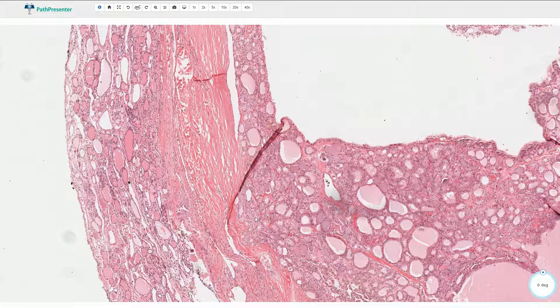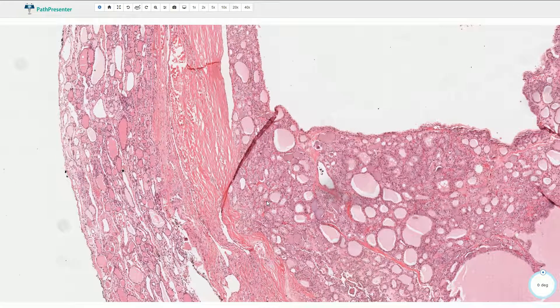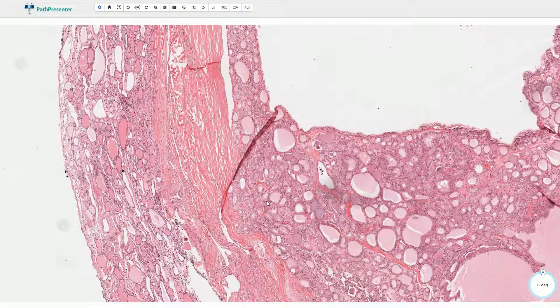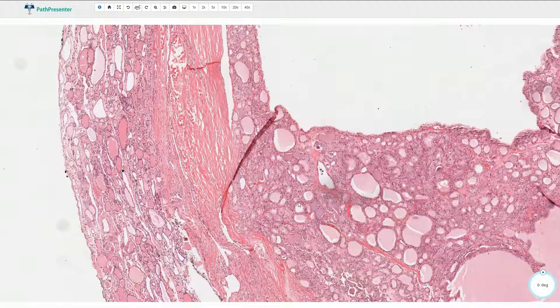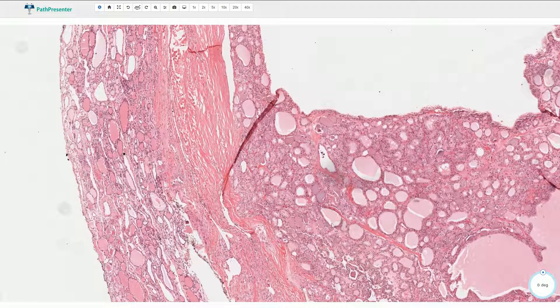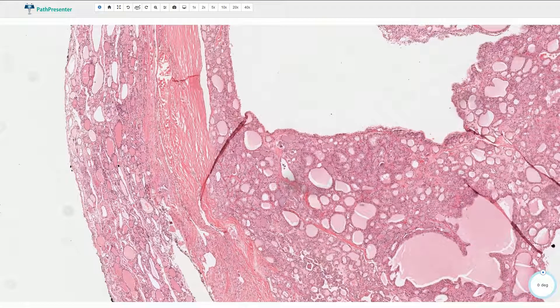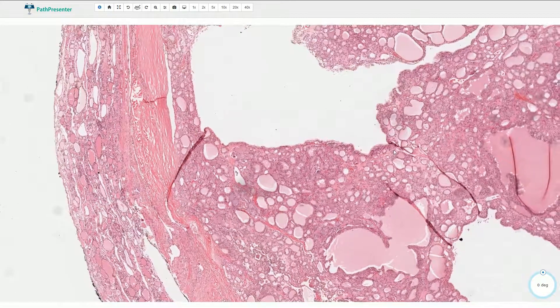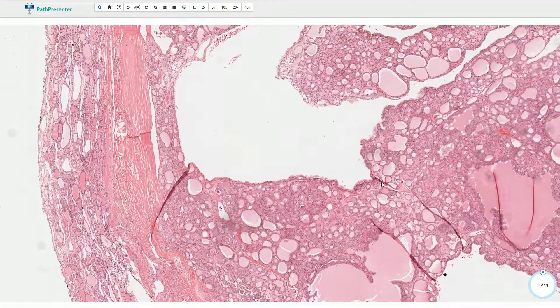Based on these facts, it is quite clear that fine needle aspiration cytology cannot reliably distinguish adenomatoid nodule from follicular adenoma and from follicular carcinoma, because we do not have the capsule and we cannot exclude invasion. On the other hand, the diagnosis of papillary thyroid carcinoma is based on nuclear features, so papillary carcinoma can be diagnosed by fine needle aspiration, and cytology is quite useful in some cases.